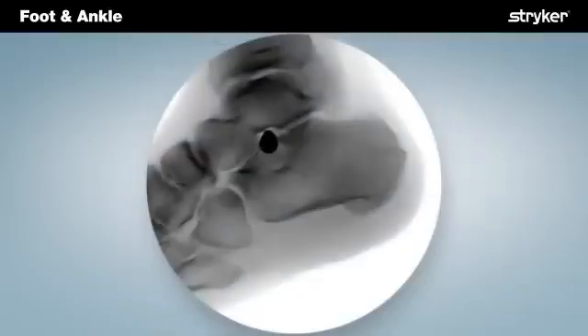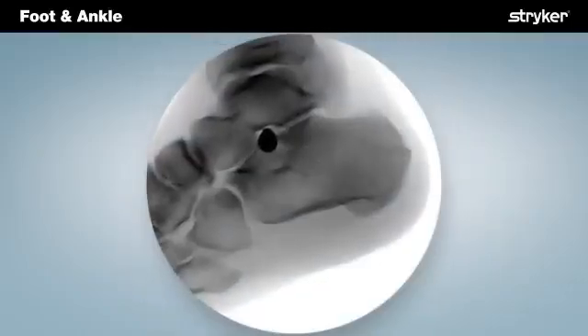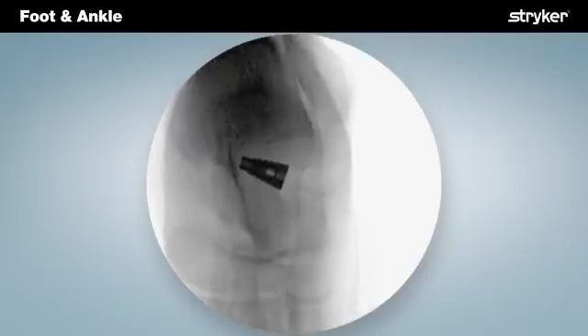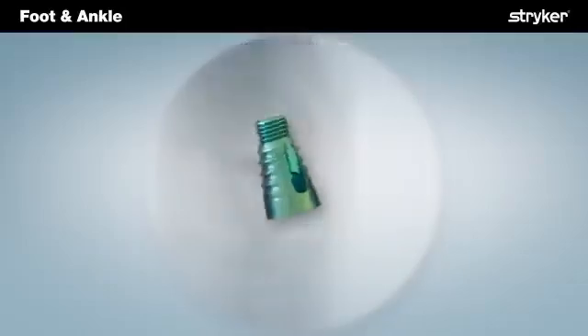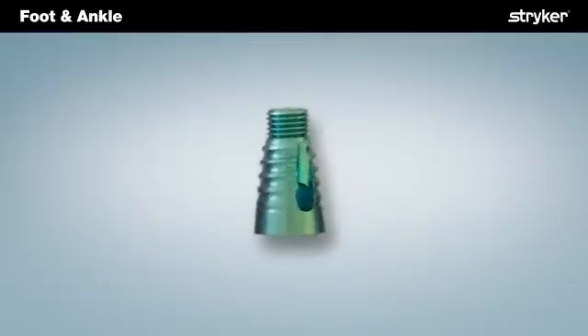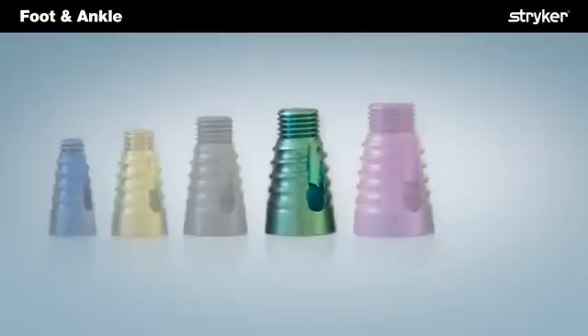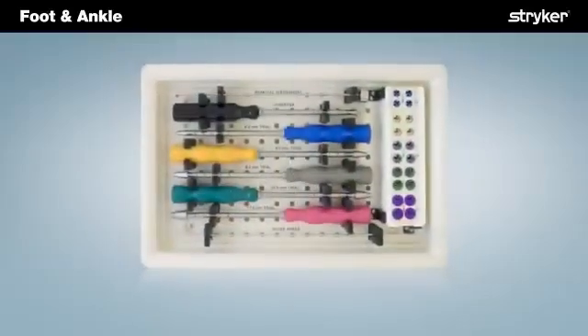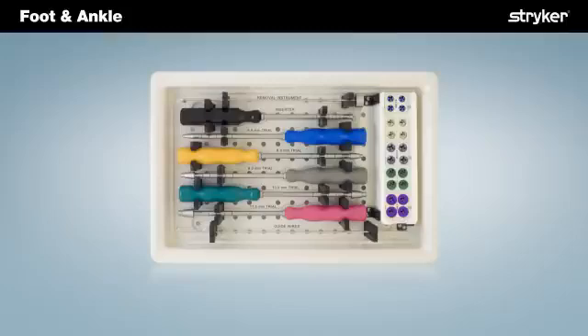Manufactured from medical-grade titanium, the SubFix arthroereisis implant features a conical anatomically conforming shape that is finely threaded medially and tapers into a wider, smooth lateral surface. Five size offerings ranging from 6.5 to 11.5 are supported with procedure-specific instrumentation.